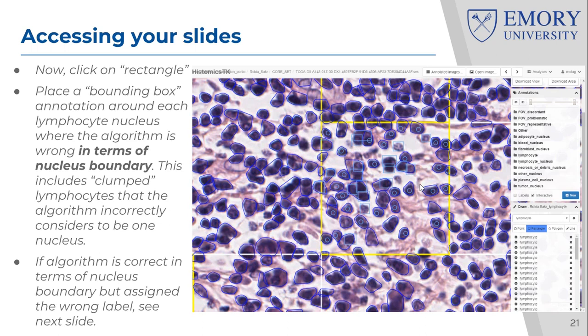Okay, so now you can see, right? This is important so that when I use your annotations, I would know anything with a dot in it is correct. I can use it as is, including the boundary. But if it's not correct and I see a rectangle, then I know we have a kind of weaker annotation. Instead of making you create all these circles and wasting your time, I kind of give you a head start. And whatever is not correct, I just let you make a rectangle, and that's good enough for me, okay? So you can see the rectangle here, here, here, okay?